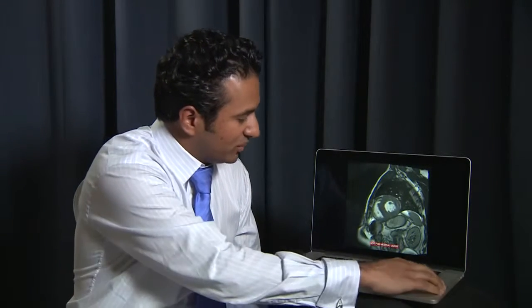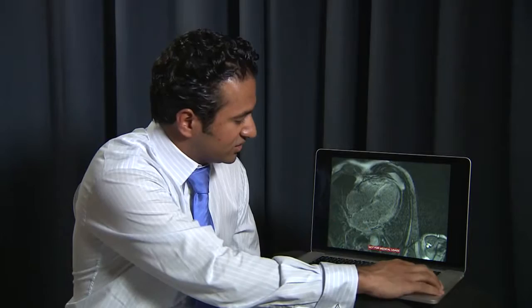Here is another example where the heart muscle is thickened, but differently from the previous case — it is quite symmetrical. When we give contrast, we can see the whole of the heart is enhancing. This patient has a cardiomyopathy, but this is an infiltrative form due to amyloid.